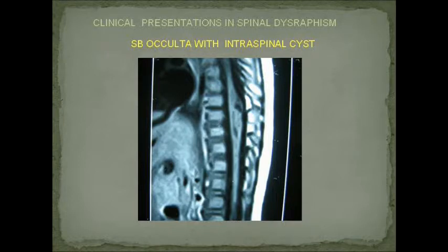A lot of people believe that if you have this lesion, and the child is otherwise neurologically normal, you should do a baseline urodynamic study in order to compare it later with any changes. I mean, that's one question in my mind I'm still not very clear about.